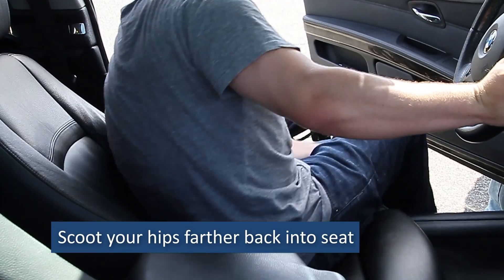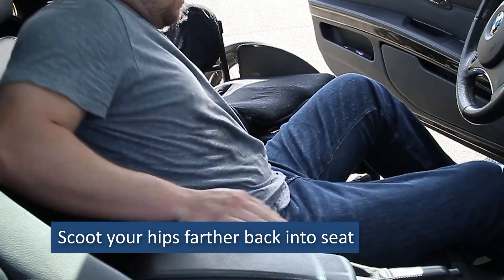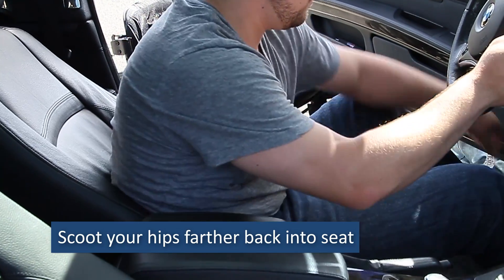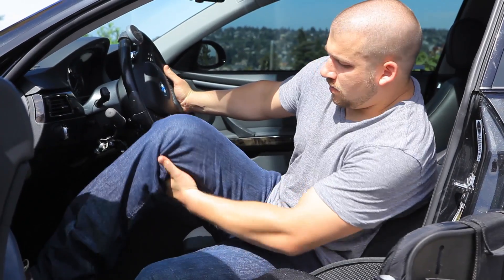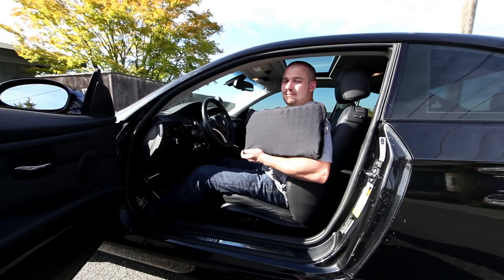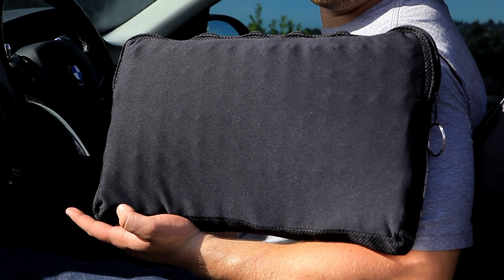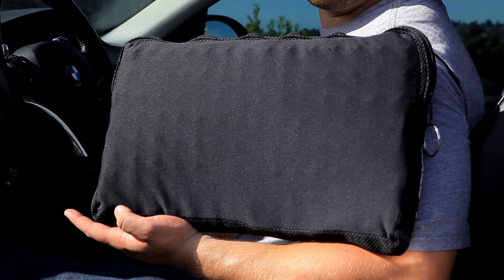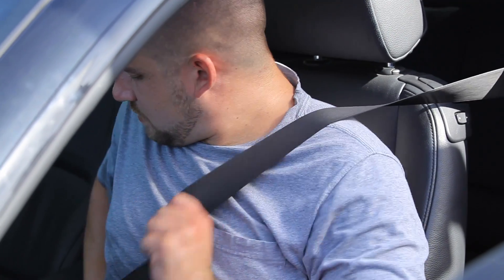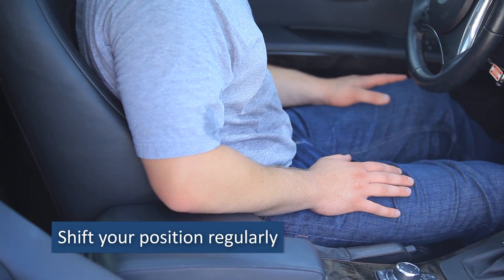After the transfer, reposition your body in the car. Scoot your hips farther back into the seat. Stabilize yourself with one hand while you use the other to bring your legs into the car. For longer car rides, some wheelchair users position a thin wheelchair cushion on their car seat to protect their skin. Whether or not you use a cushion, once you're belted into your seat, plan to shift your position regularly to prevent skin breakdown.